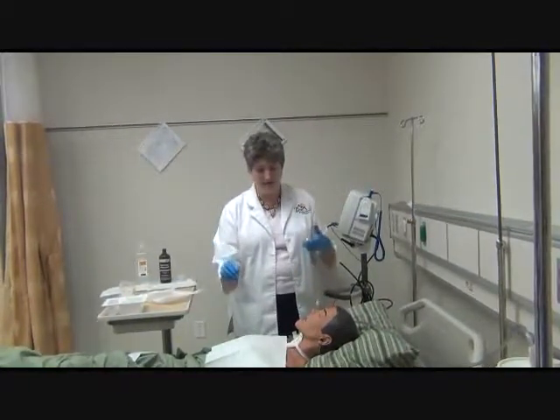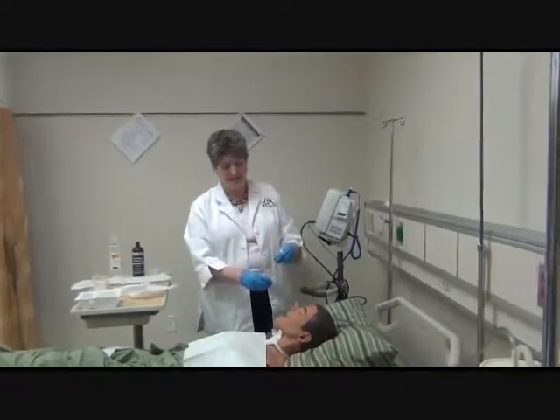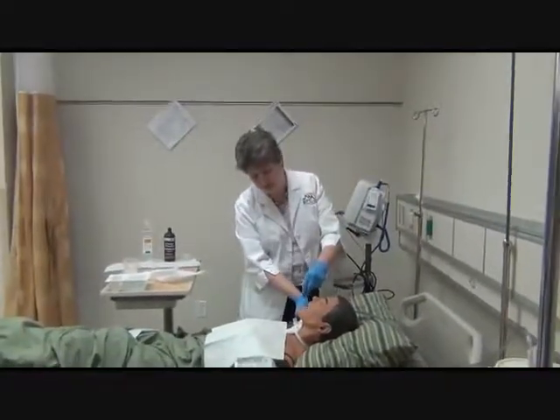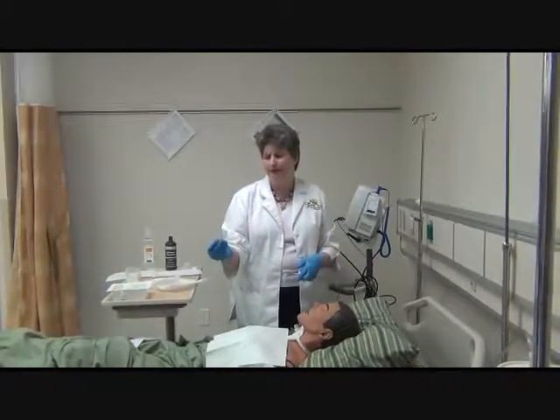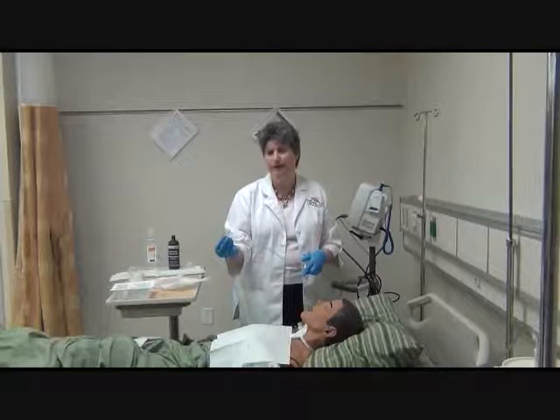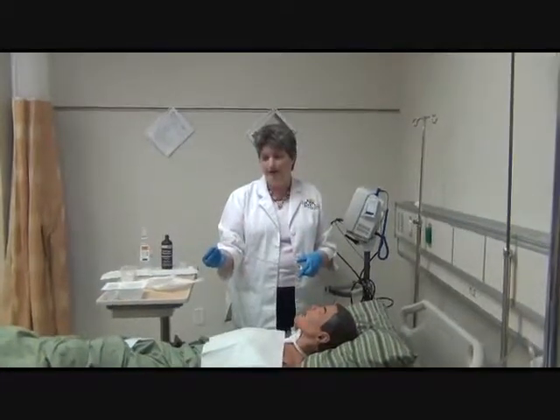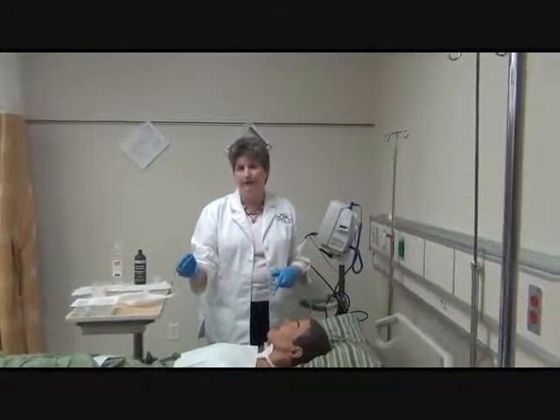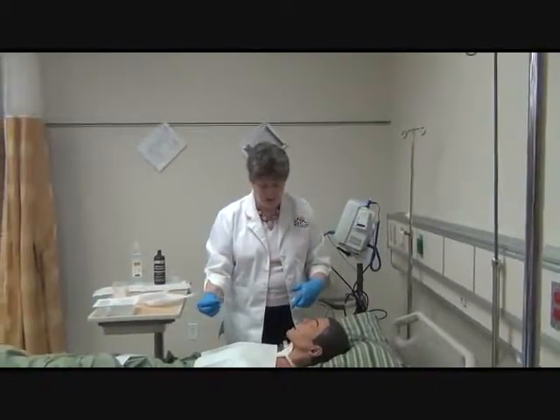So we check this. I'm now going to check the distance that I want to put it in. Some catheters are marked off with centimeter markings, so you'll know. You want to try to prevent irritation of the carina. So take your time.